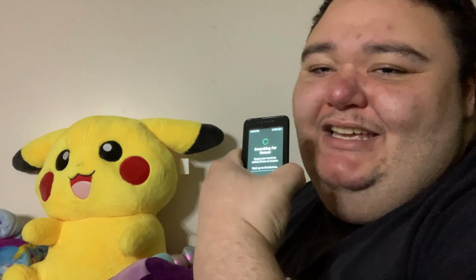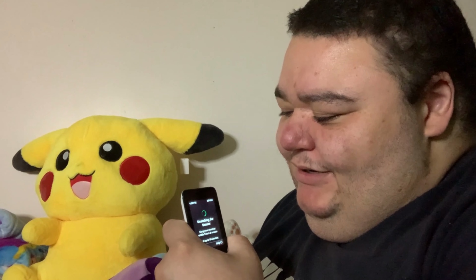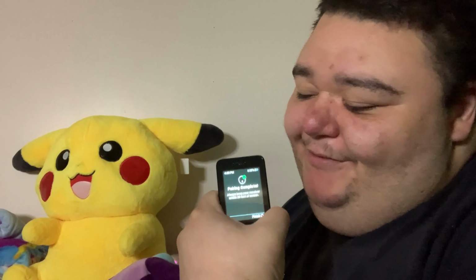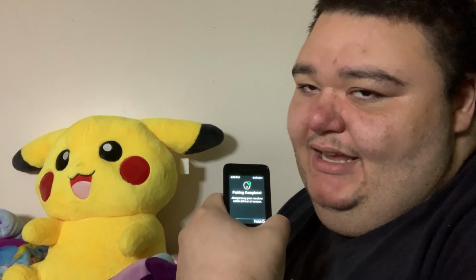Once you enter the code, you hit submit, searching for the sensor. It says keep within 3 feet of the sensor, and then it pairs. And that was pretty fast too. Usually it was slow the last time.